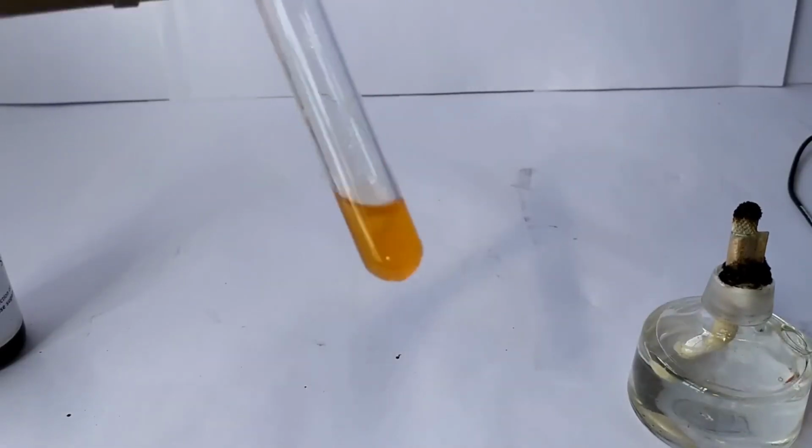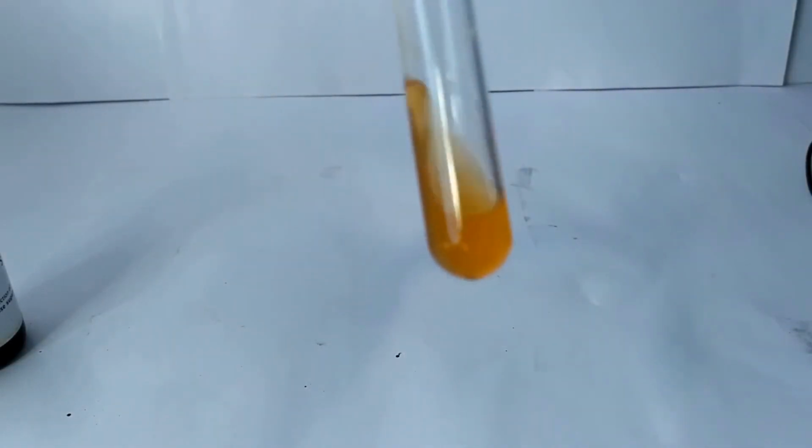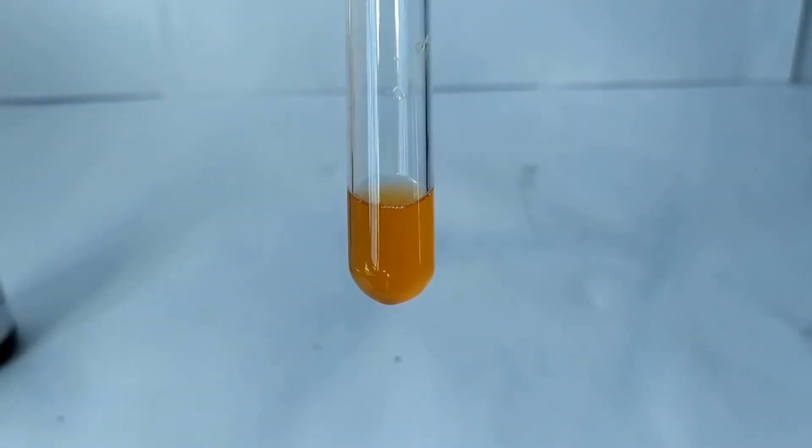The formation of a red color in the tube is considered as positive test for fructose. No change in color indicates an absence of fructose in the sample.